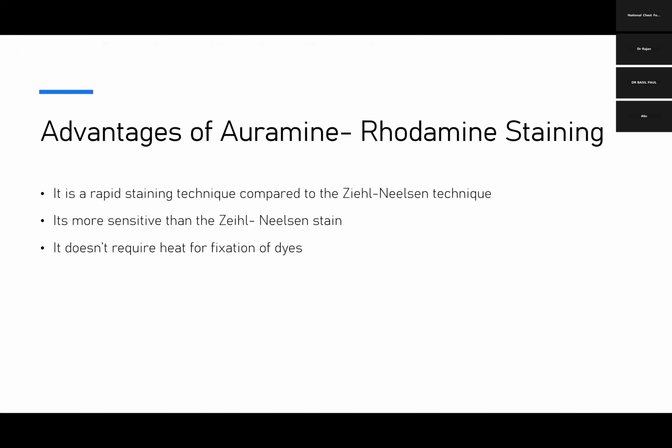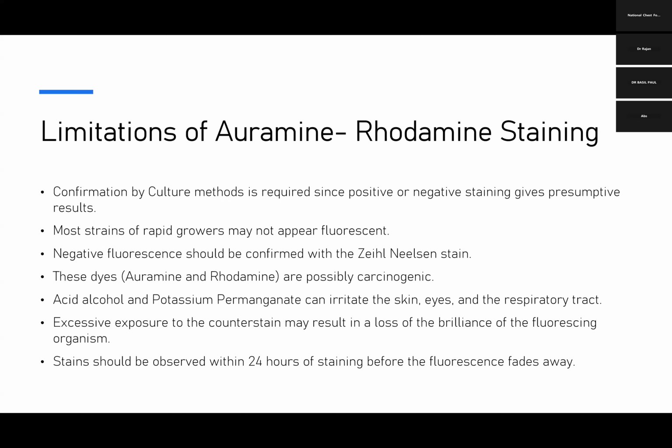It is a rapid technique as compared to Ziehl-Neelsen. It is more sensitive than Ziehl-Neelsen, and it does not require heat fixation. You need to steam fix, but you do not need heat fixation for dyes. And the number of fields you have to observe is a little bit less. So it is a little bit less time consuming. But there are some limitations of auramine rhodamine.